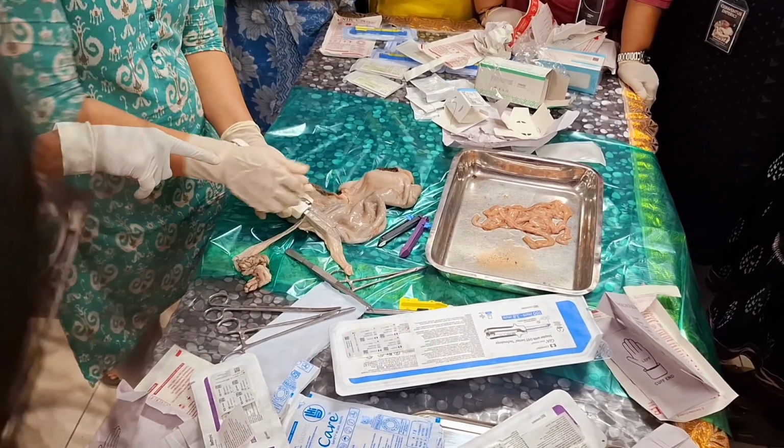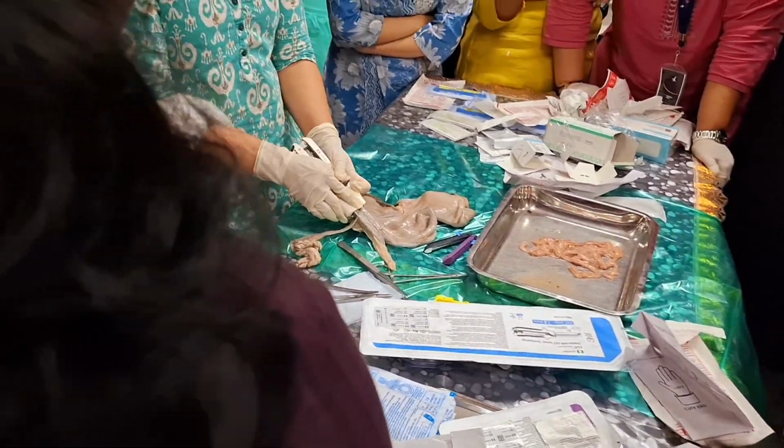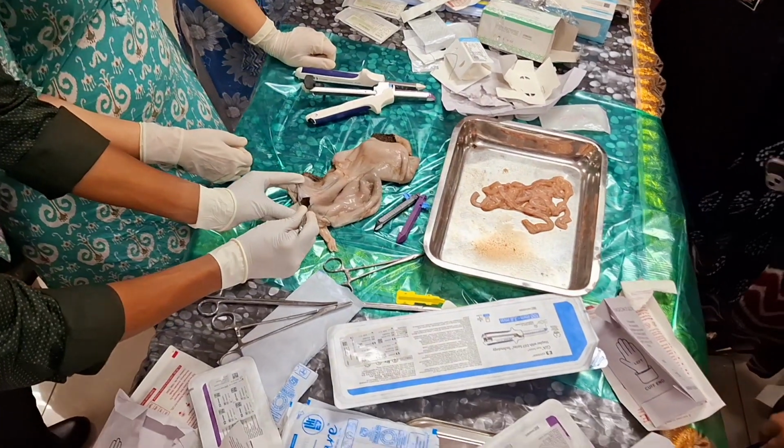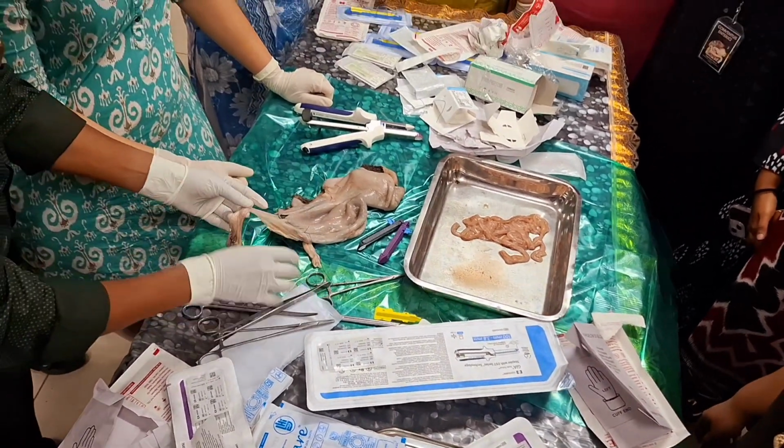At the end, you will apply clips. Now the level is anastomosis, right? So this is how you do a gastrostomy. After this, we have to close this. Okay. Now one of you do it.